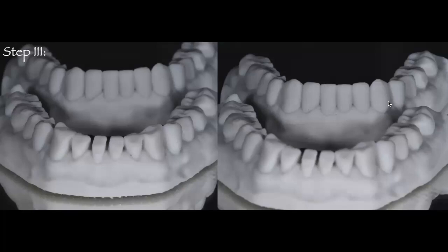But of course, because we're only adding wax to the anterior guidance and none on the posterior teeth, this is going to increase, that's what we call a segmental increase of the vertical dimension. We're going to increase the vertical dimension segmentally, only adding to the envelope of function.